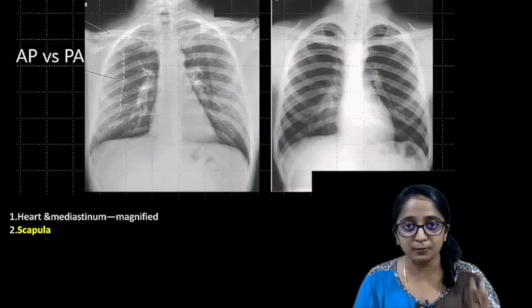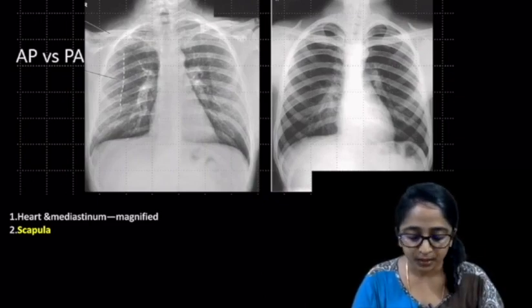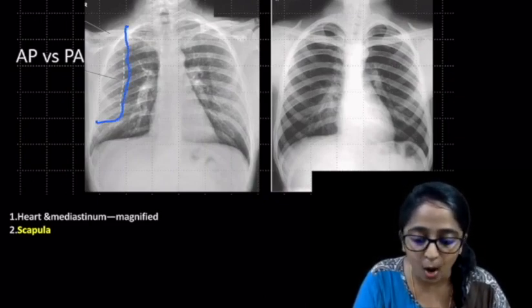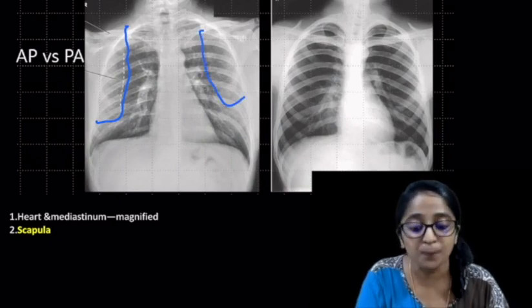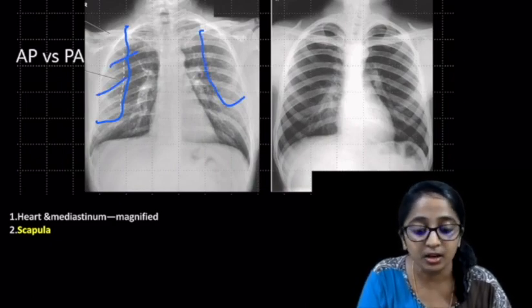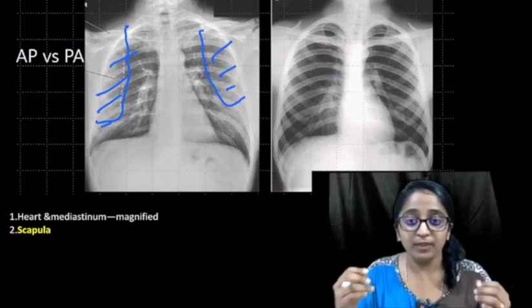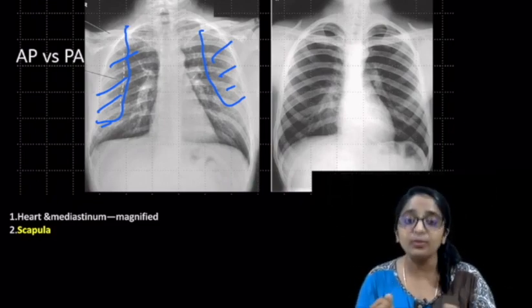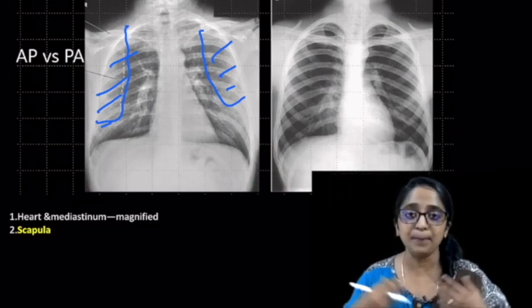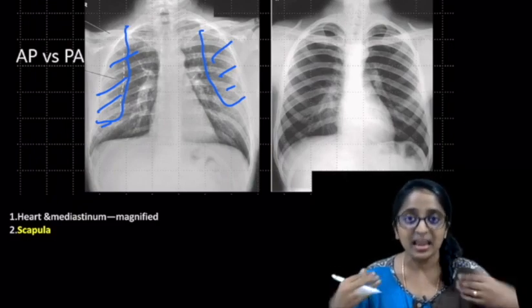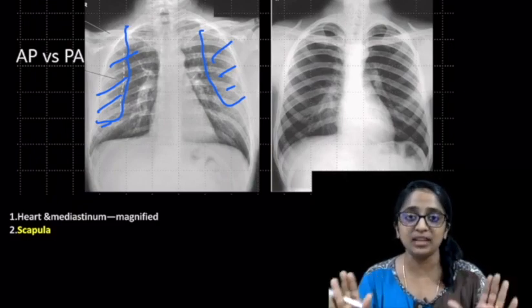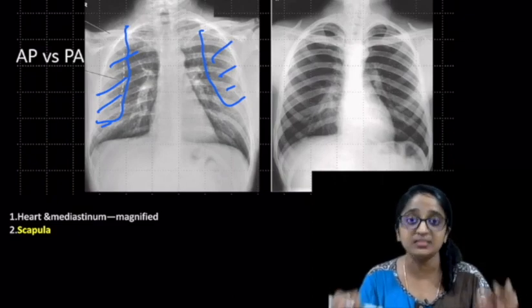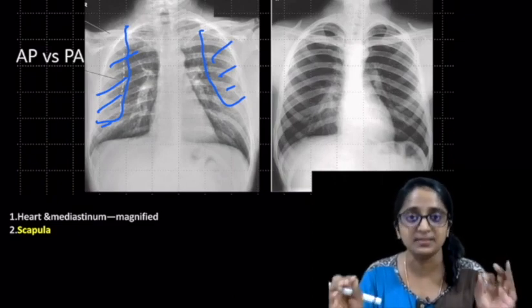Coming to the second difference between AP and PA view. In the AP view, you can see the scapula overlying the lung fields, obscuring a greater part of them. Whereas in the PA radiograph, due to the inherent positioning, you can ask the patient to rotate the shoulders and project the scapula out of the lung fields. So less of the lung fields is obscured by the scapula.